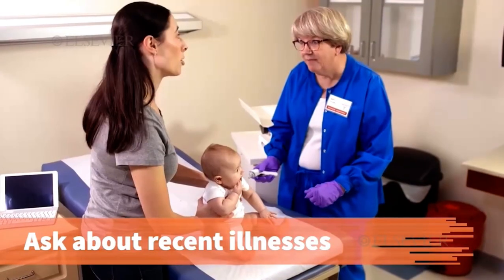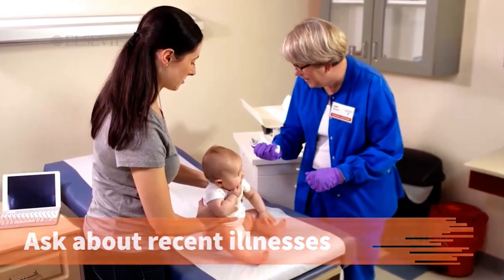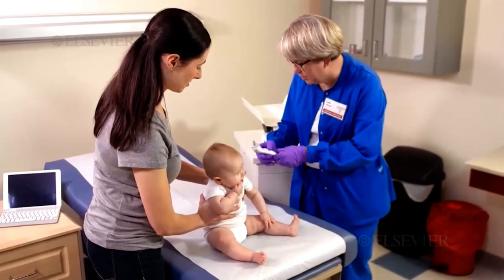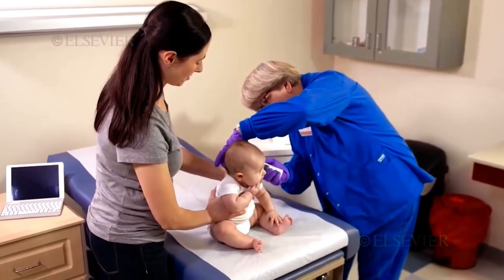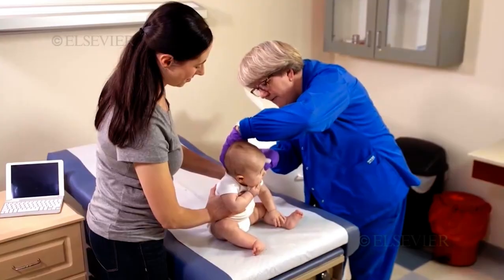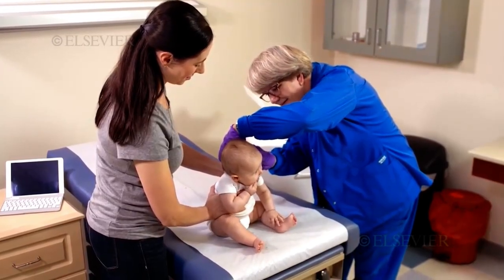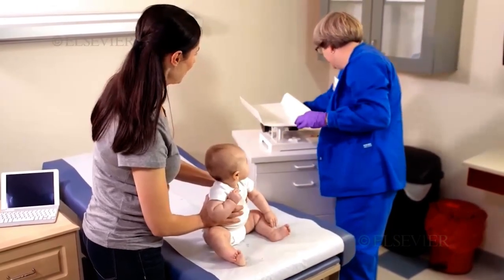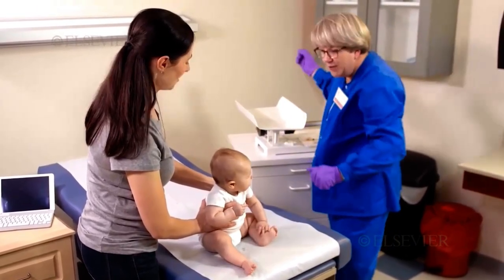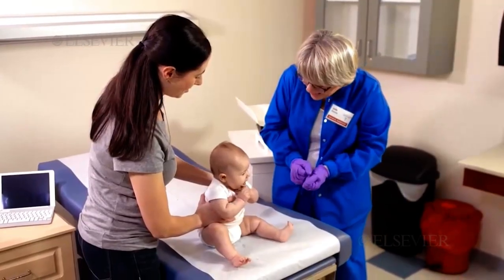Has she been sick recently? No, she has not. Great. We're just going to get her temperature, just to make sure. Refer to facility policies if the child has a fever and/or the caregiver reports a recent illness. 97.6 — we're in good shape there. So now she's all set to get that Hib vaccine.